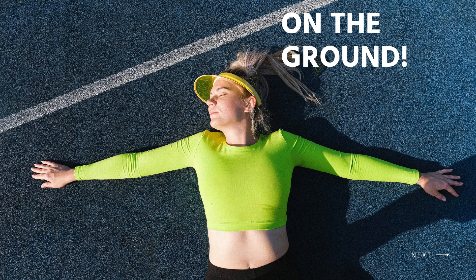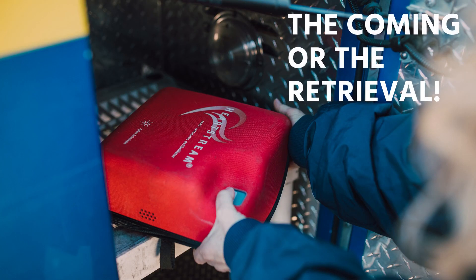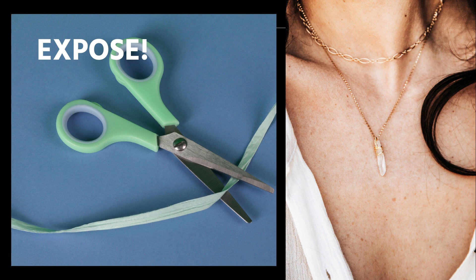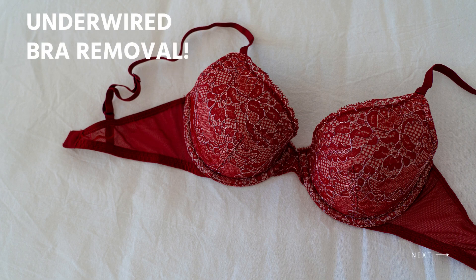Let's talk about the steps of defibrillation on this woman. With the arrival of the AED kit, immediately stop what you're doing. Use the trauma shears or scissors in the kit for cutting through her clothing to expose her chest. Use the small towel in the kit for wiping away any moisture on her chest.